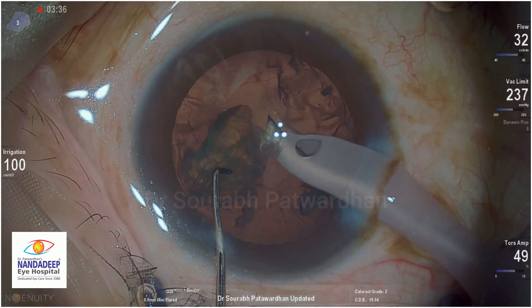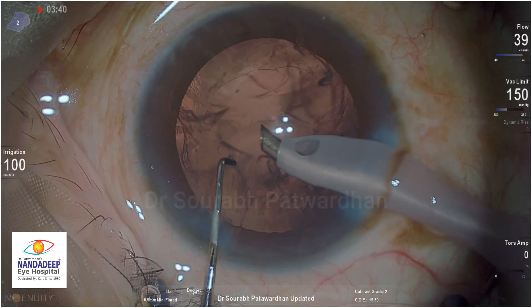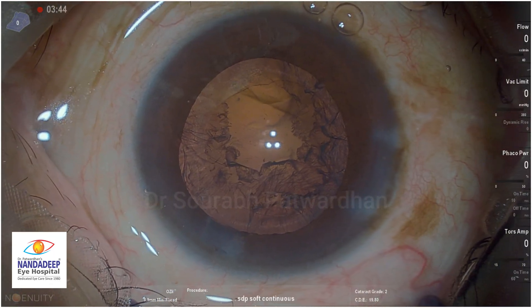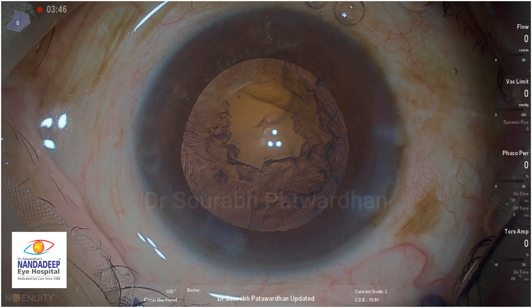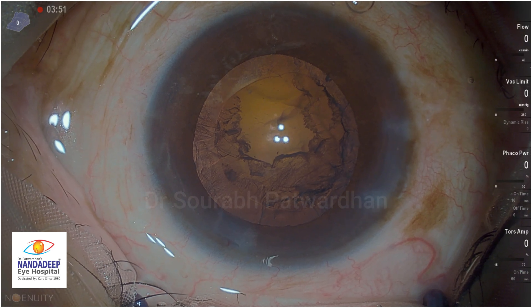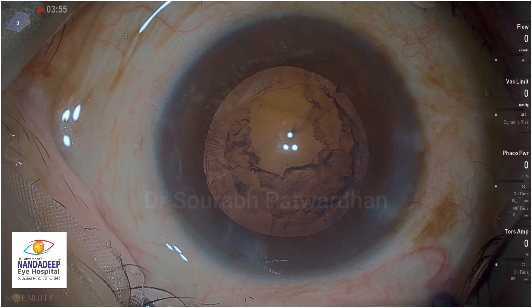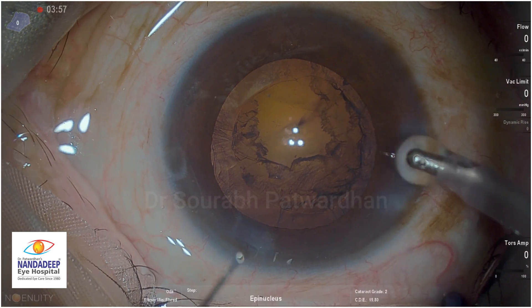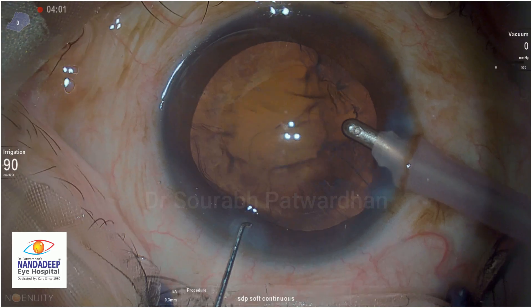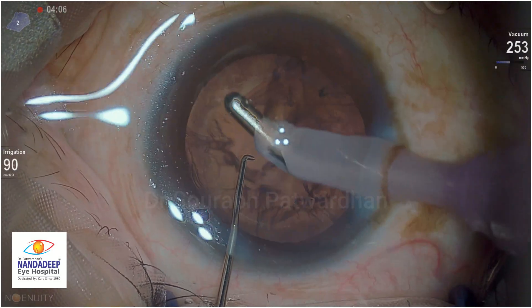With minimal phaco, you might have noticed that I have used the balance tip here, but you can very efficiently do the cataract removal. The Constellation has a very useful phaco system - it provides a very stable anterior chamber and very safe removal of the cataract. So for those who use Constellation for retina, they can use the same for doing phaco as well. It's very efficient and safe.